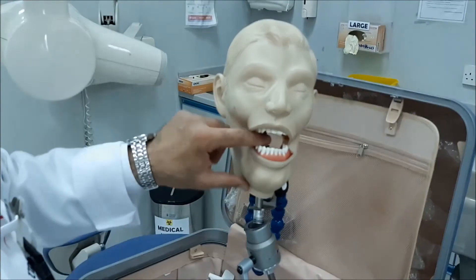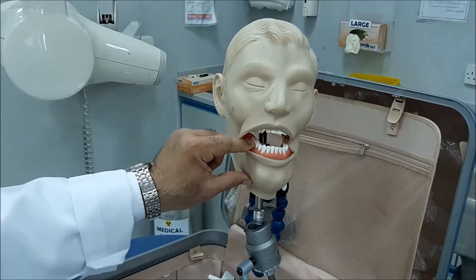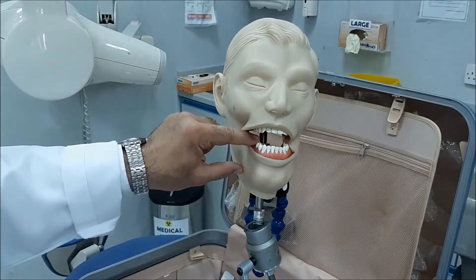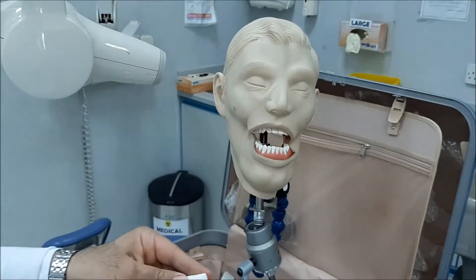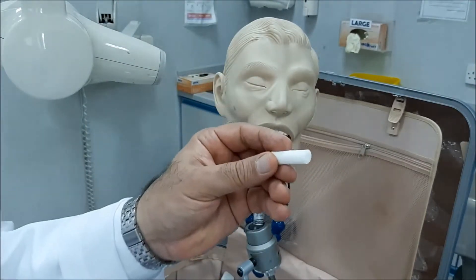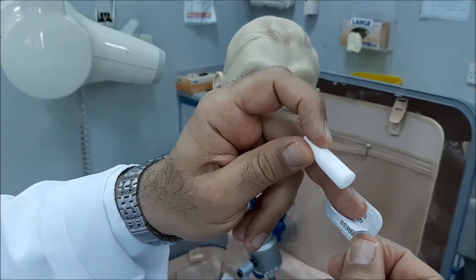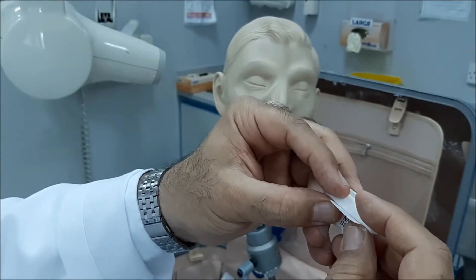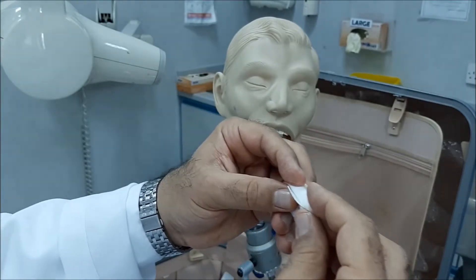Sometimes it happens that the patient is edentulous on one side and you need to do the bitewing. In this case, suppose you're going to replace the missing tooth with the opposing tooth with a cotton roll. So if you're doing the premolars and the premolars were missing, you will put a cotton roll here to replace the crowns of the premolars, and then you ask the patient to bite.